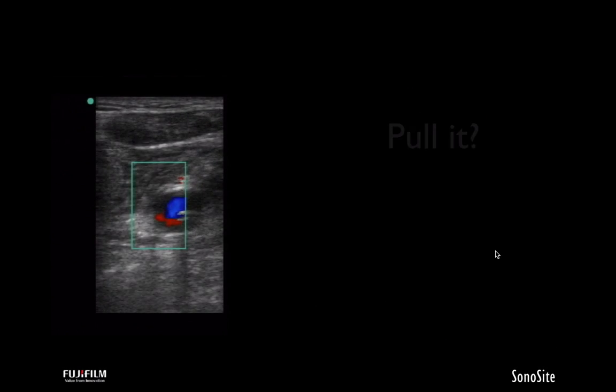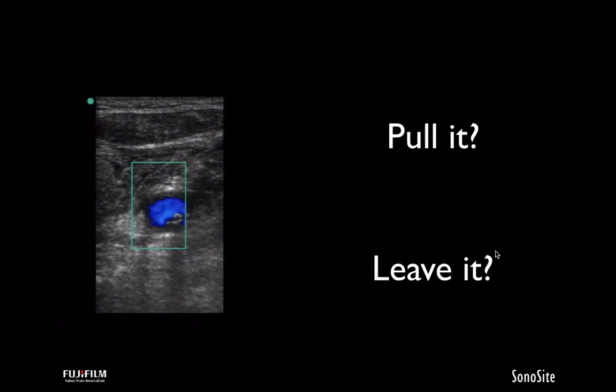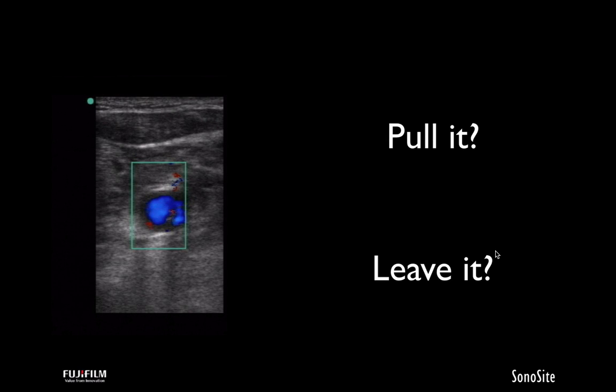So now back to our patient. You have this, and I'm on rounds. Do I pull it or leave it? I'll tell you, when I was a resident, I used to pull these all the time, whenever we, by mistake, cannulated the carotid artery, and hold pressure. This was a classic thing we did in the ICU.